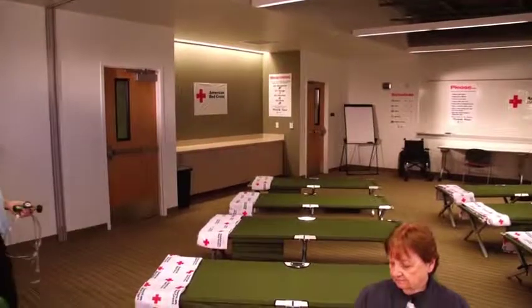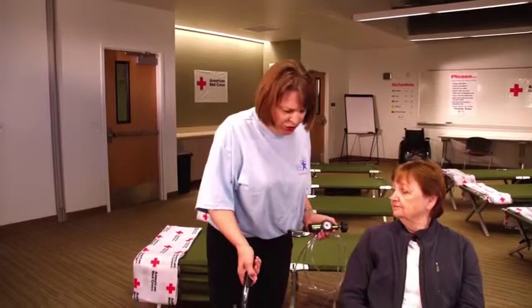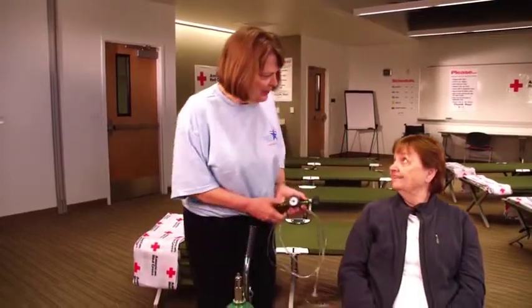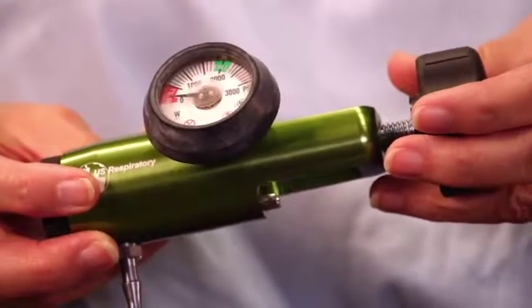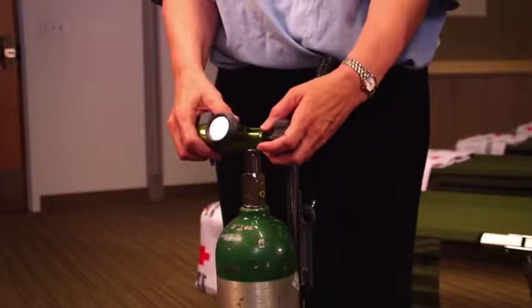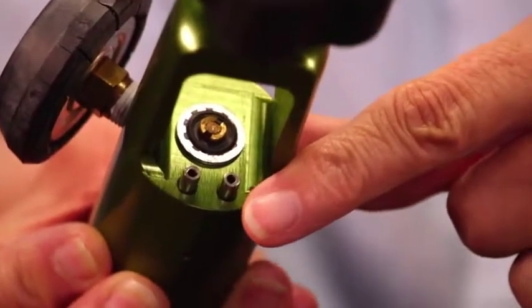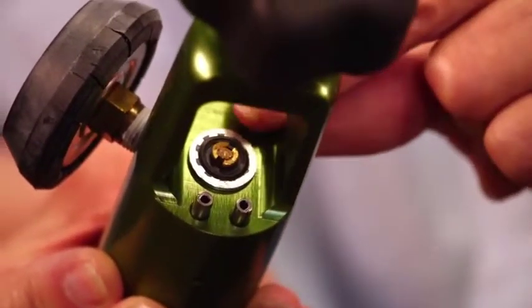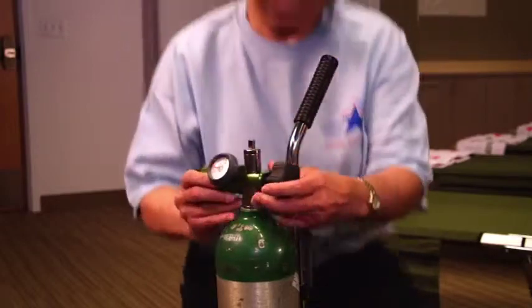Attaching the regulator to the oxygen tank is the first step in getting oxygen to the individual. The oxygen in the tank is under great pressure and needs the regulator to make it breathable. Place the regulator over the top of the tank, lining up the two prongs and the O-ring. When fitted in place, tighten the black knob securely.